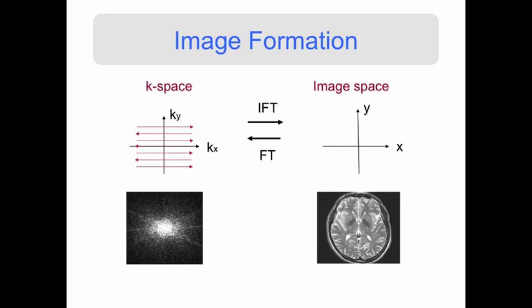The raw measurements you get from an MR scanner look like the image to the left here. It looks like you've dropped a bunch of salt or something on a black table. But if you look at this in 3 dimensions, it's a mountain where there's a big peak in the center and it goes down as we move away.